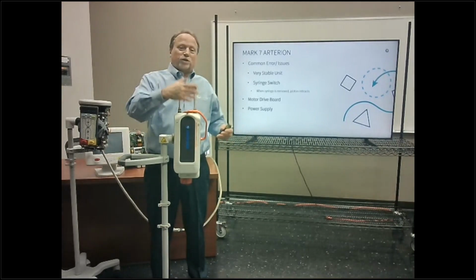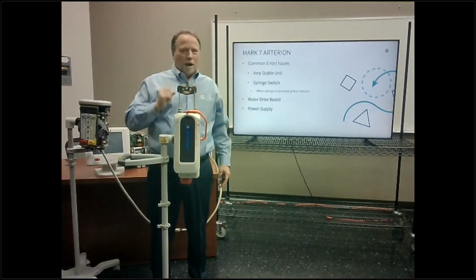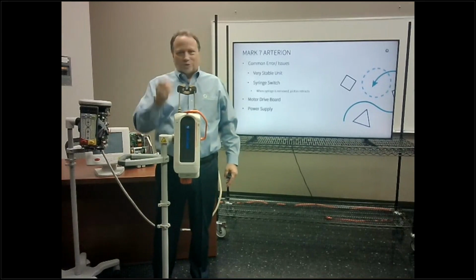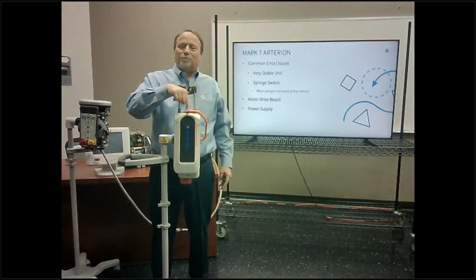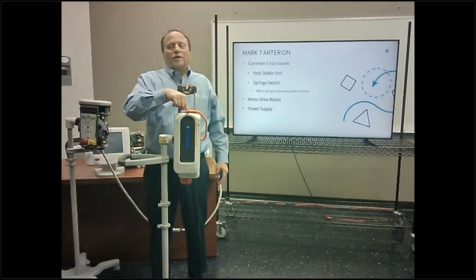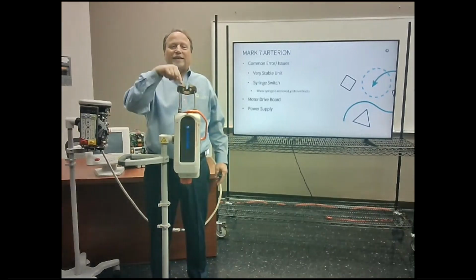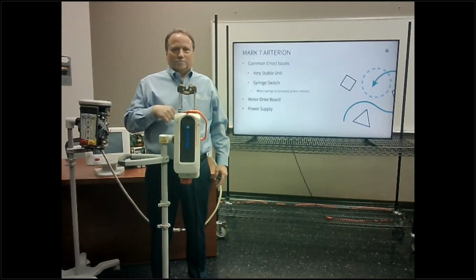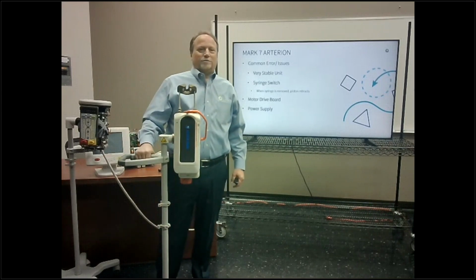Well, you take the pressure jacket off, and you get in there and you clean it, and it pops up. And then the piston retracts. It's just that simple. This is probably the number one cause for service calls, right there, that pin. It gets glued down. Keep that in mind when you get, my piston won't retract.